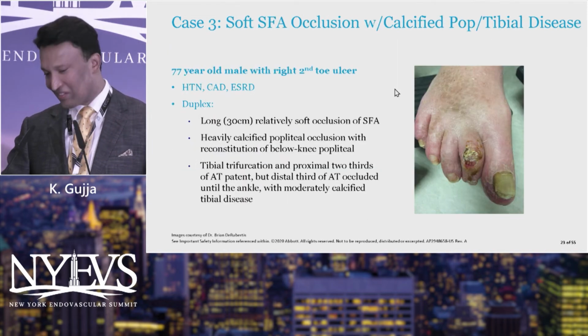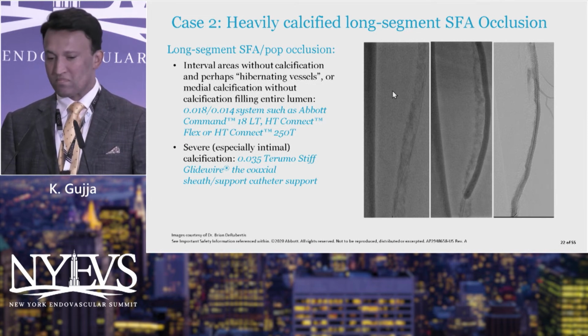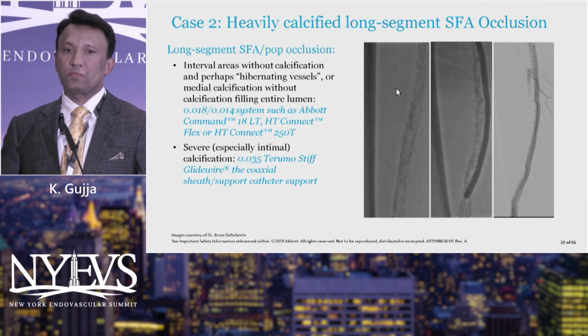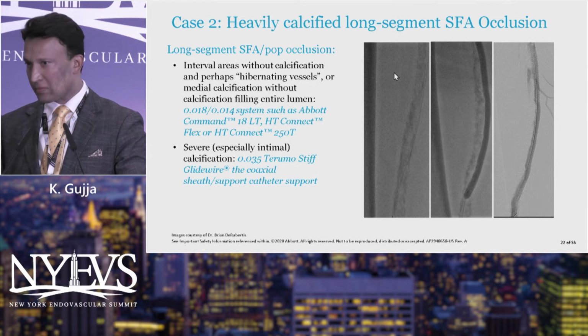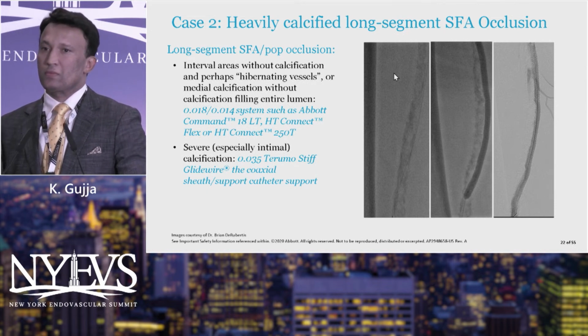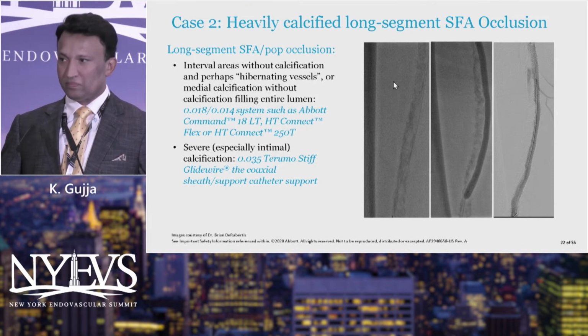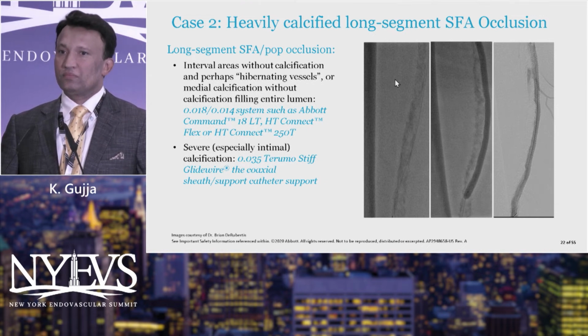The one thing I want to say is, guys, I know you're cardiologists, but I think the vascular surgery colleagues will agree. Time here is very important. Don't pretend that you'll get any bang for your buck by being intraluminal. This is not a coronary. You're not going to leak MBs. You're not going to worsen the ejection fraction. So you want to traverse the lesion as quickly as possible, with as little effort as possible.